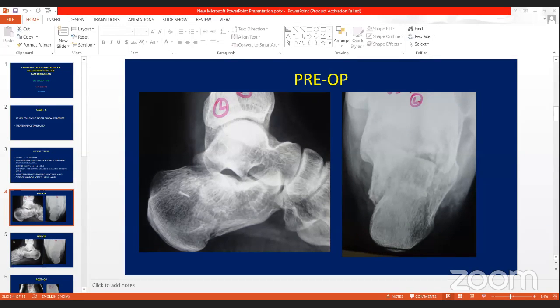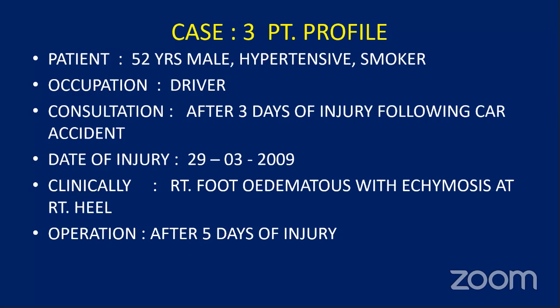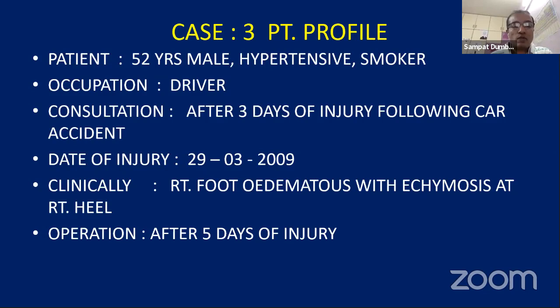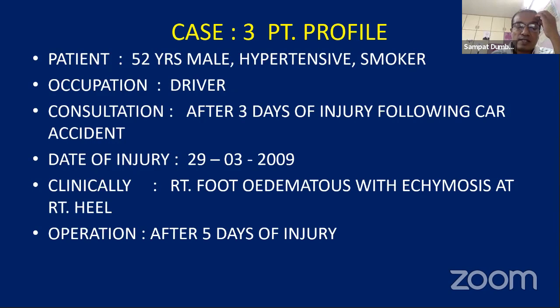Before that, Sampat sir, can you enlighten us? The patient was diabetic. Will you go for a sinus tarsi approach or just a minimally invasive screw approach if the depressed fracture like this is not coming up much? So I don't hesitate to go for sinus tarsi approach because healing is pretty good. Only thing is don't go for bulky implants. I agree. For elevation, I will go for a sinus tarsi approach.